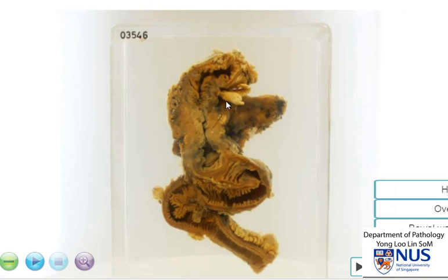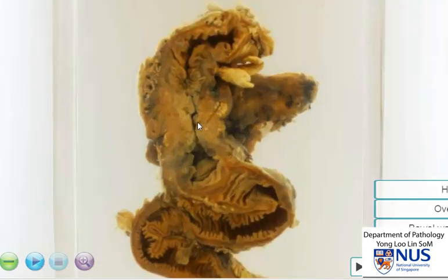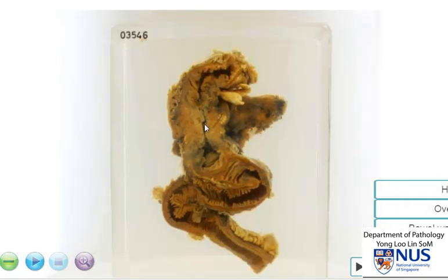So, in summary, this is a case of intestinal tuberculosis, giving rise to adhesions of the bowel loops and involving the ileocecal region, also giving rise to marked thickening of the bowel wall due to granulomatous inflammation and narrowing of the lumen, as well as several enlarged pericolic lymph nodes.